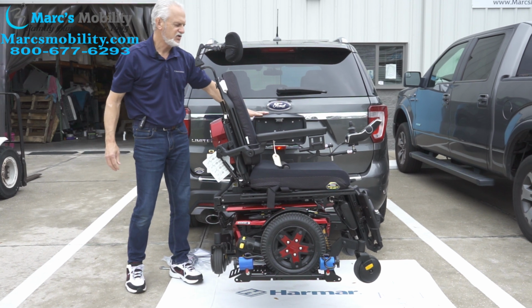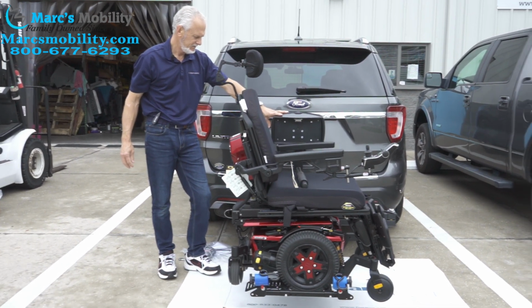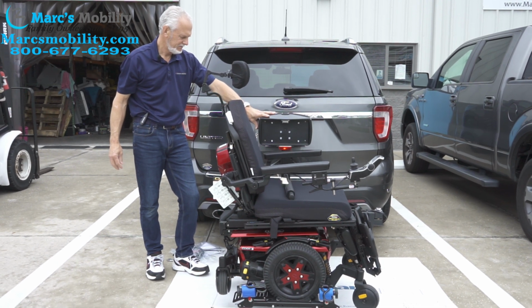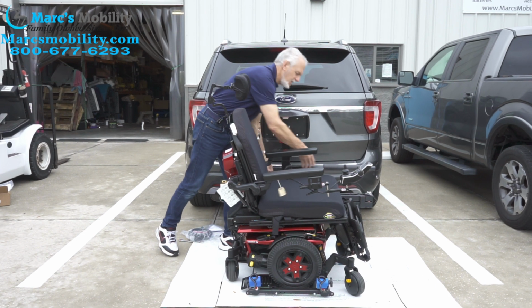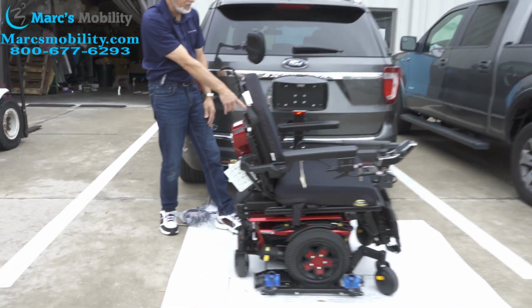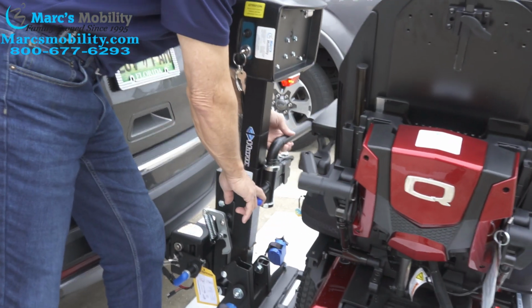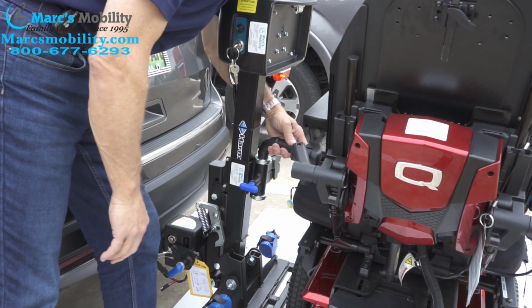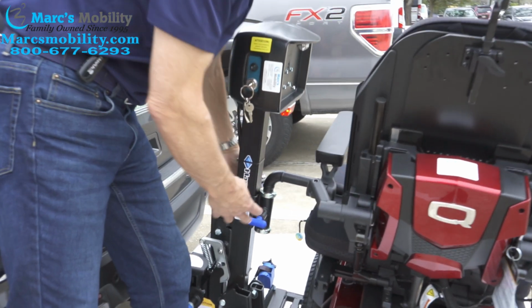And then I'm going to drop the chair down. We're going to take the arm off the seat. And the arm, there's a blue handle over here on the side. You can see right from the side here. You can see right here, pull the blue handle, put the arm over the seat, and it's secured. You will have to adjust this arm right here to any chair you have.